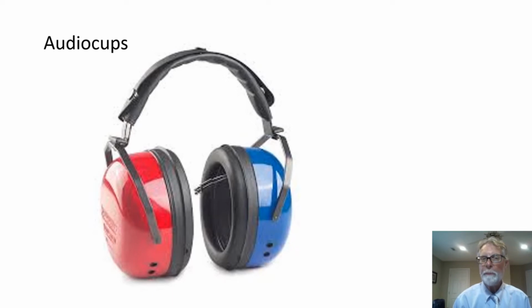But then you can order audio cups installed, and they will do some noise reduction and help you get away with a little bit more ambient or environmental noise.